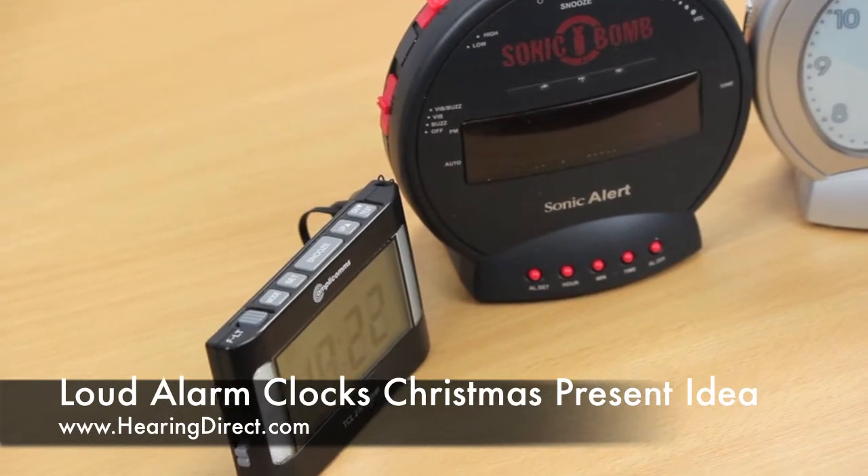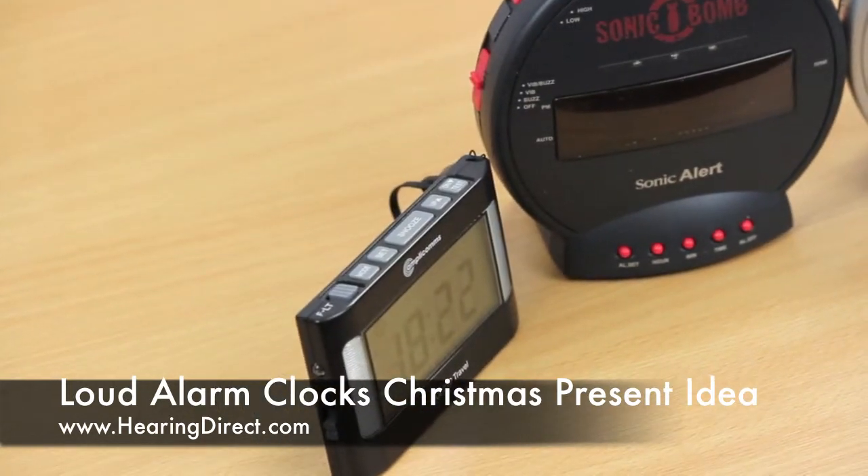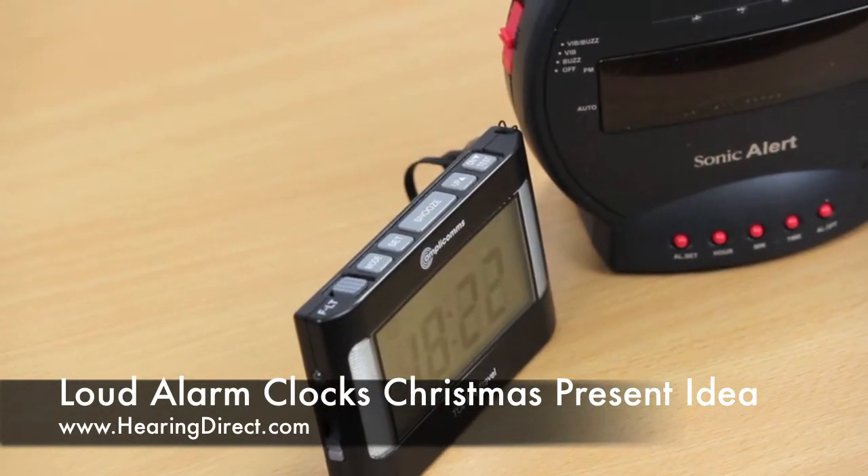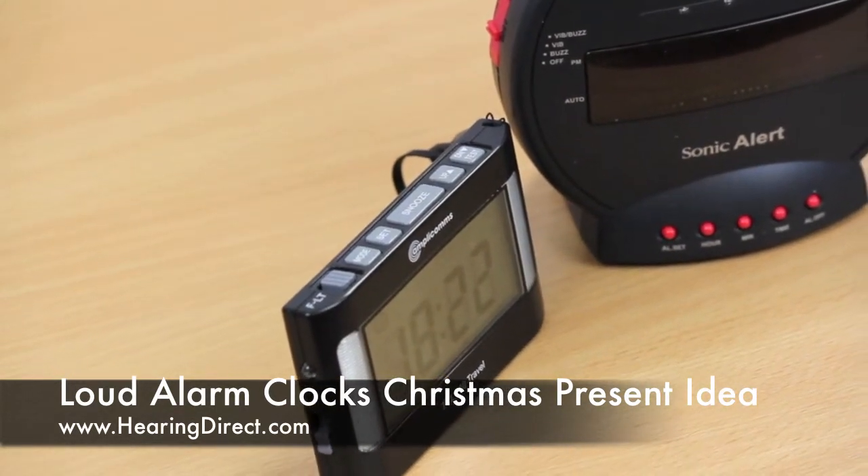For that little travel alarm clock from Amplicom, the batteries are estimated to last anywhere between 8 and 10 months, and you will need AA batteries for that particular option.